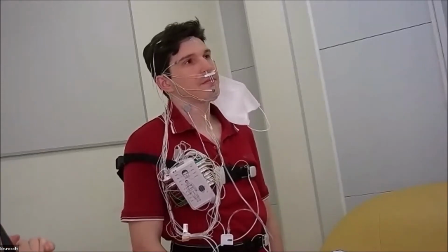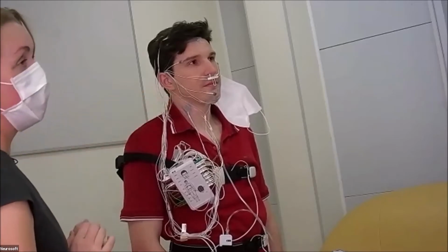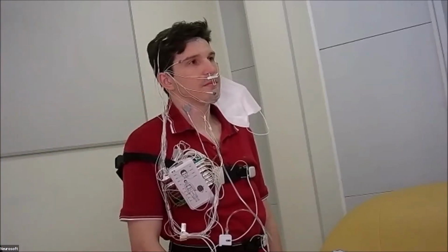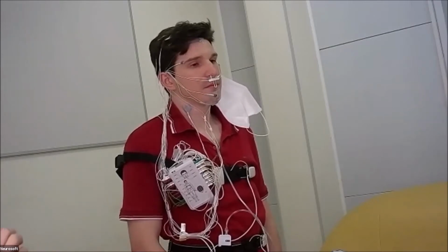The next one is the snore sensor. This is a sensor placed on the skin. We need to ask our patient to imitate snoring, and we find on the skin the place where the vibration is the strongest. Then we put this sensor there and fix it with medical tape.